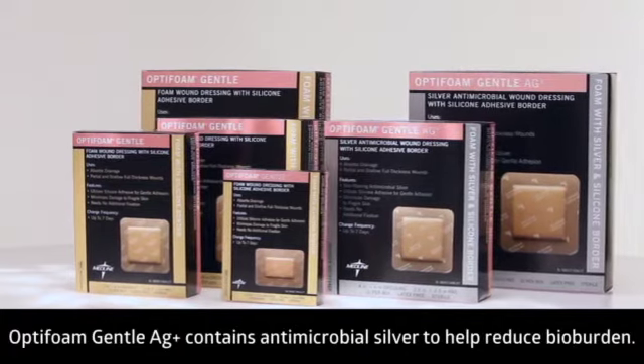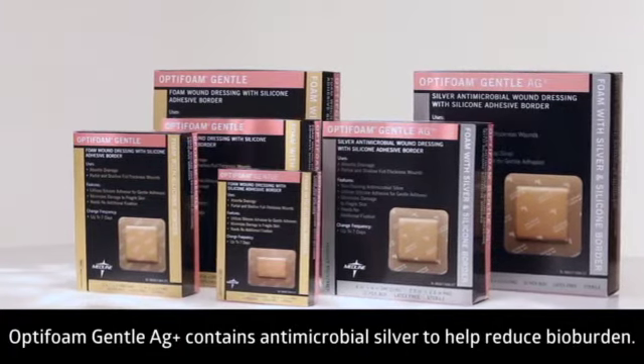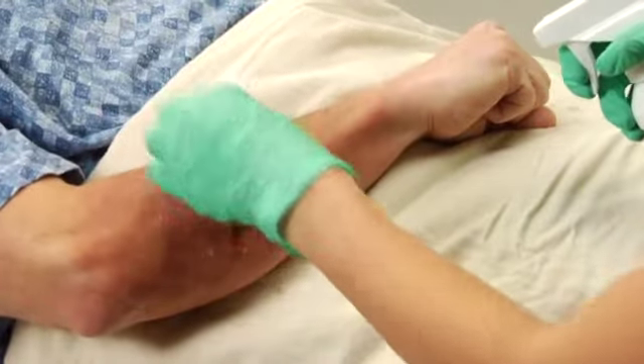Optifoam Gentle AG contains antimicrobial silver to help reduce bio-burden. Begin by donning gloves and cleansing the wound environment.